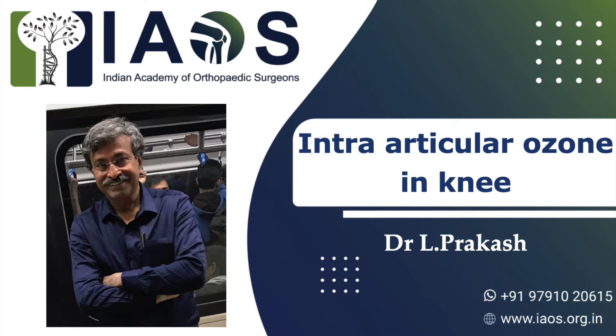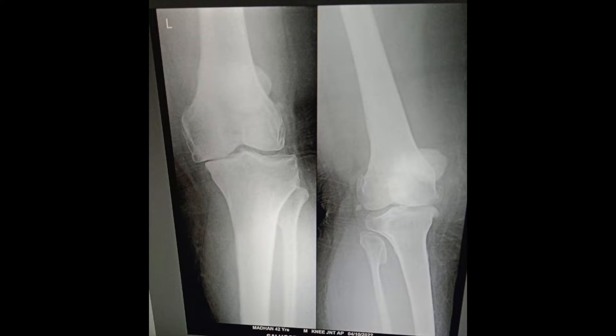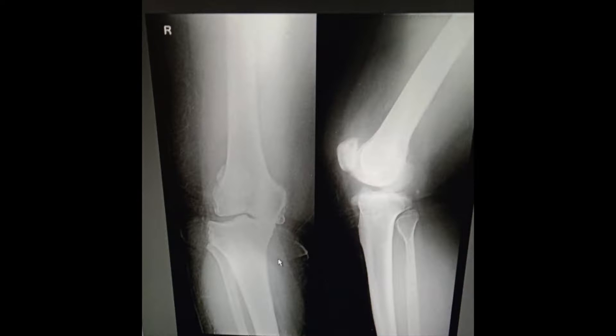This short video demonstrates the use of intra-articular ozone in a knee. The patient was from Sri Lanka, 119 kg in weight, and had severe osteoarthritis of both knees, unable to walk more than 100 meters.